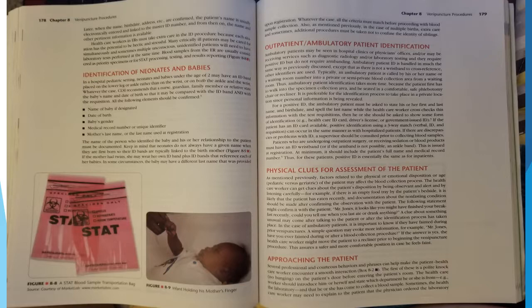The name of the person who identified the baby and his or her relationship to the patient must be documented. Keep in mind that neonates do not always have a given name when they are first born, so their ID bands are typically linked to the birth mother. If the mother had twins, she may wear her own ID band plus ID bands of each of her babies. In some circumstances, the baby may have a different last name that was provided upon registration. Whatever the case, all the criteria must match before proceeding with blood sample collection. Also, as mentioned previously, in the case of multiple births, extra care and sometimes additional procedures must be taken not to confuse the identity of siblings.